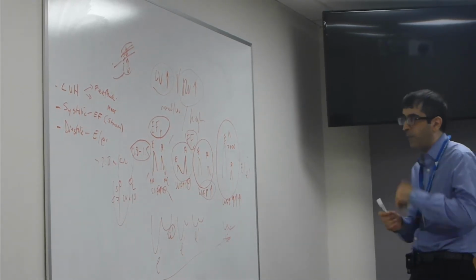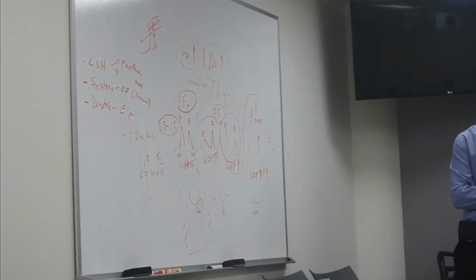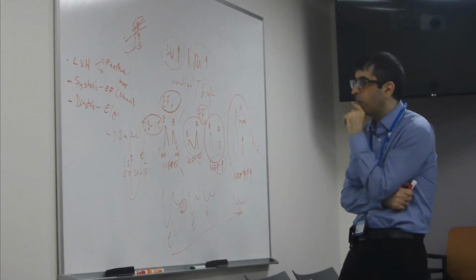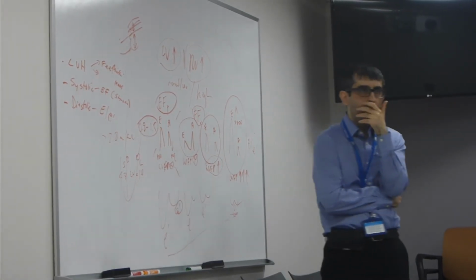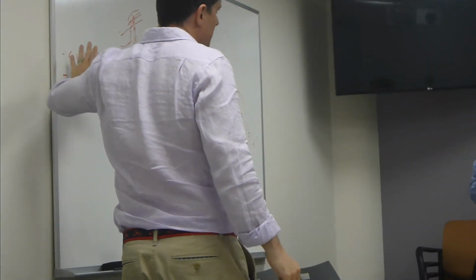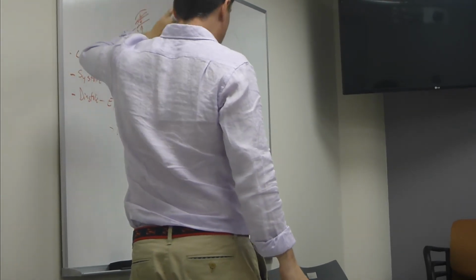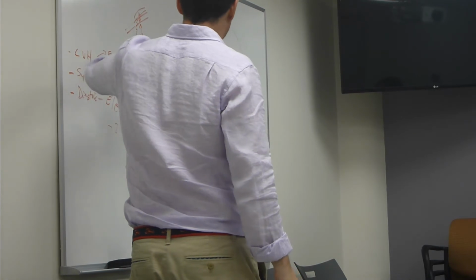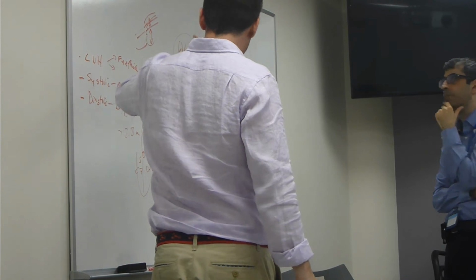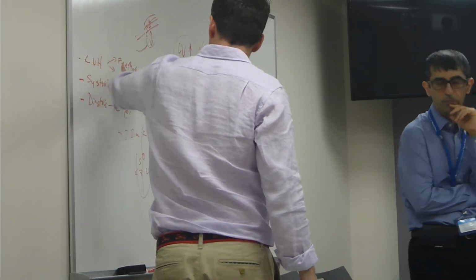So tying this back into a screen for hypertensive heart disease, sort of what the PI for this study is thinking about, we're going to do these three assessments. Like if someone has LVH, then they are hypertensive heart disease positive. So the rest of it doesn't matter as much, we'll still do it. Systolic, we're going to either measure or visually estimate, let's say above 55% versus below 55%. So these two are pretty straightforward.